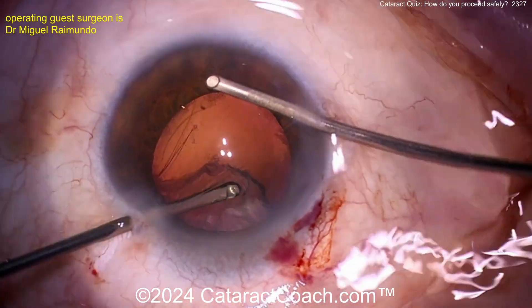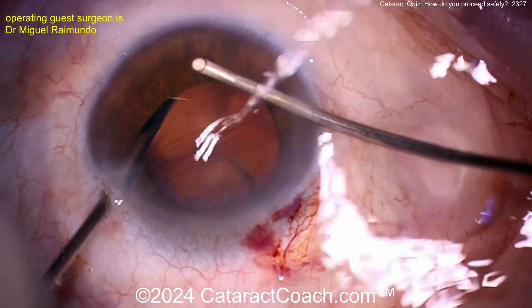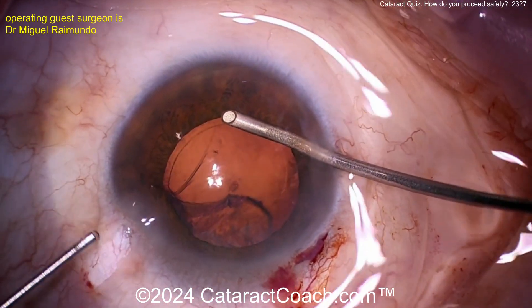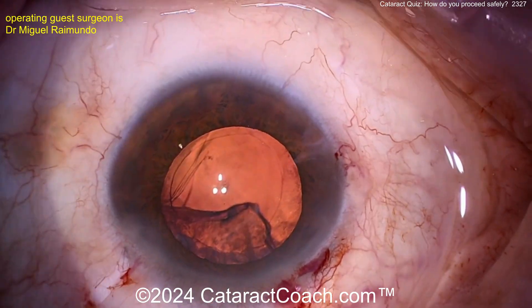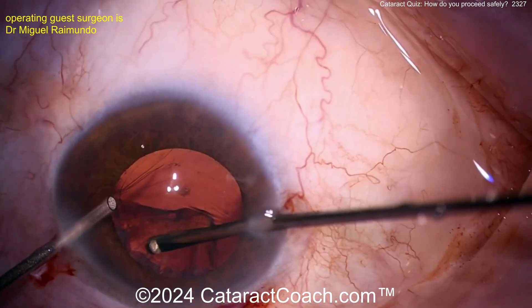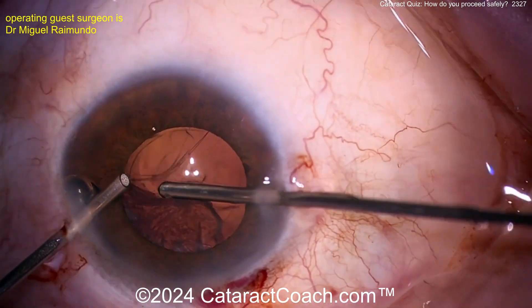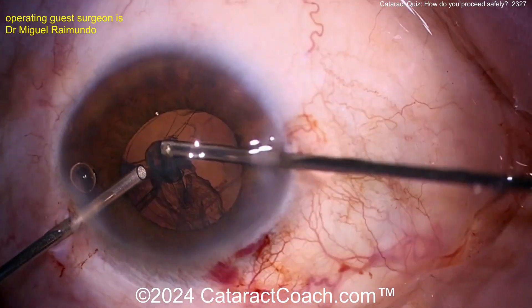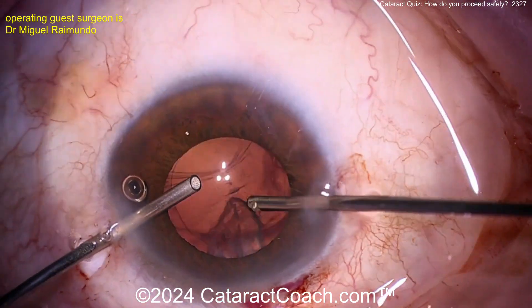Think about your lens choice: do you want to put the lens in the bag with that break, or do a sulcus lens? For me, I'm thinking three-piece IOL, haptics in the sulcus, optic capture. More viscoelastic — always a good move before exiting the eye. Get that cortex out; if you do nothing, material will fall into the vitreous cavity — I promise you that, it'll be a hot mess. Cleaning that cortex up nicely.